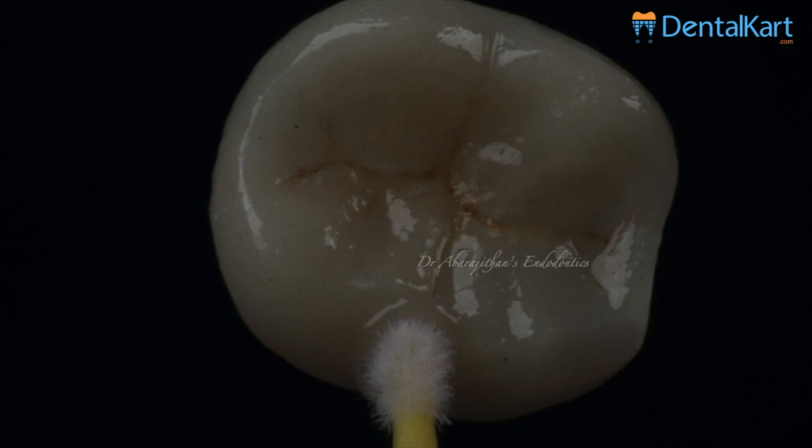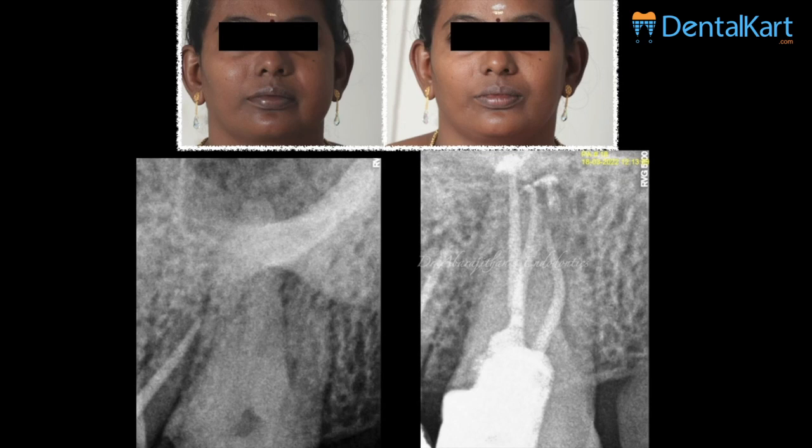This cracked tooth was later restored with a bonded restoration. Case number two is again a necrotic tooth with a periapical lesion — the patient reported with acute swelling — a left maxillary second molar, which was also treated in the same manner with the four files. This was the second use of this particular set of rotary files. This tooth was a little more curved than the first case — you can see the nice curve in the distobuccal canal.